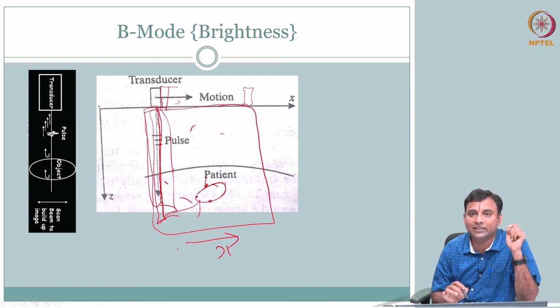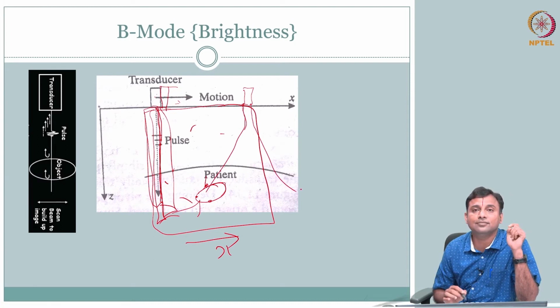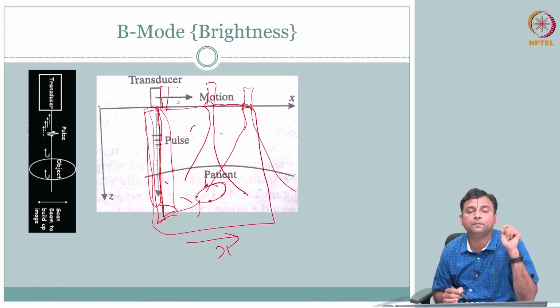You see the challenge. When you have a transducer like this, what is going to happen? The beam pattern is going to diverge; we talked about this. You might say, we talked about having a lens. The lens will help, depending on the setup.